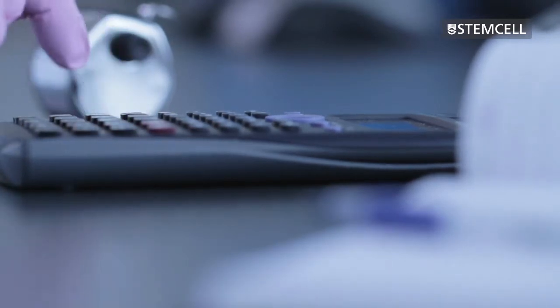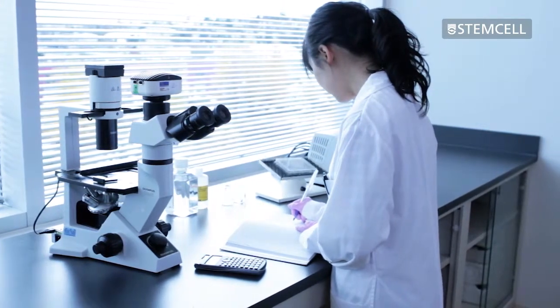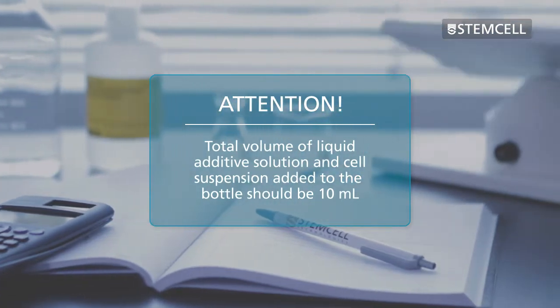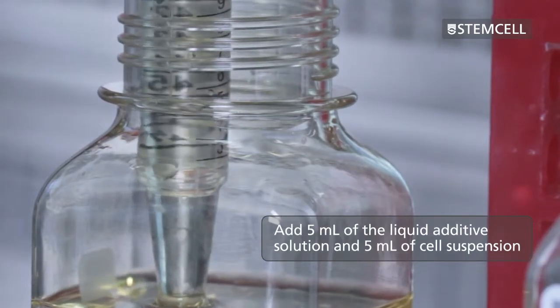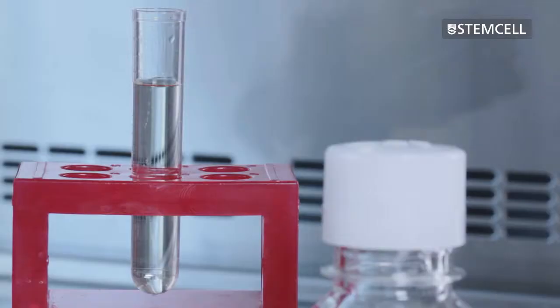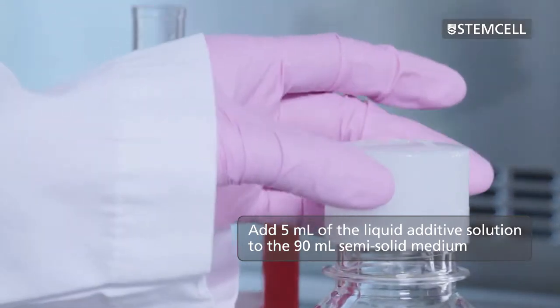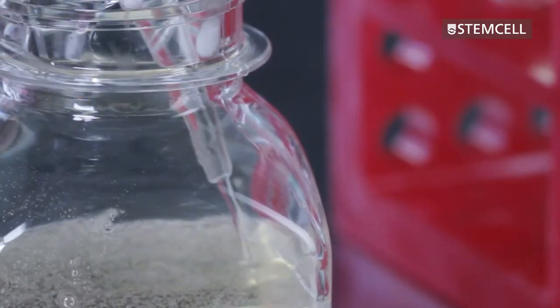Calculate the amount of selection agents and supplements to be added to the semi-solid medium, and prepare the liquid additive solution in ClonaCell CHO CD liquid medium. Remember, the total volume of the liquid additive solution and the cell suspension added to the bottle should be 10 milliliters. In this video, we add 5 milliliters of liquid additive solution and 5 milliliters of cell suspension. Add 5 milliliters of the liquid additive solution to the bottle of semi-solid medium. Your bottle should now contain 95 milliliters of supplemented semi-solid medium. Shake the bottle vigorously to mix the medium.